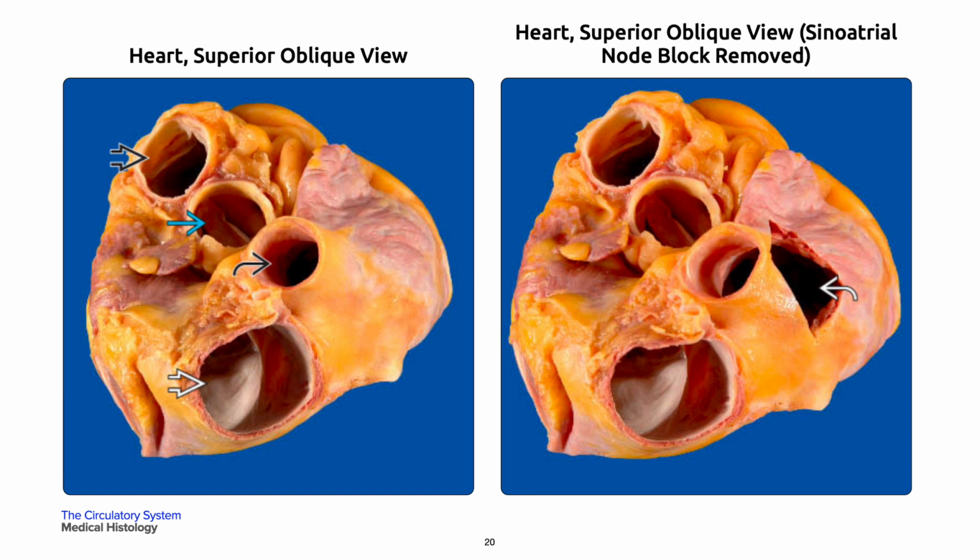On your right is a block of tissue, in a curved white arrow, along the lateral border near the superior vena cava connection, containing the sinus node, that has been removed from this heart. Internally, a segment of the terminal crest in the right atrium is removed with this block.